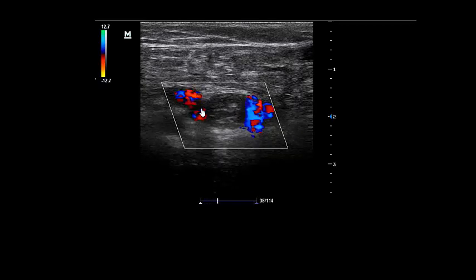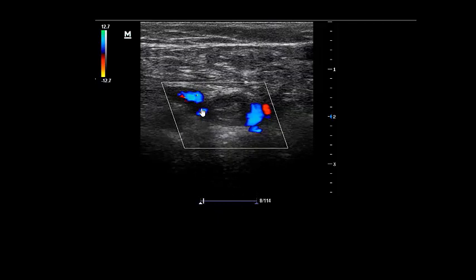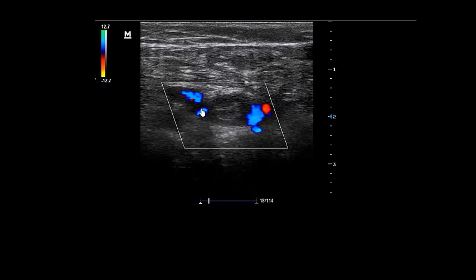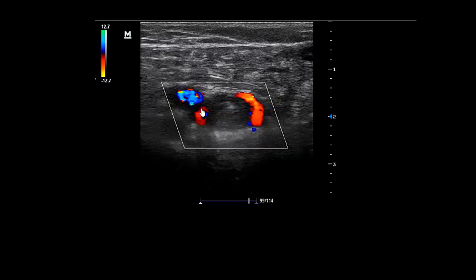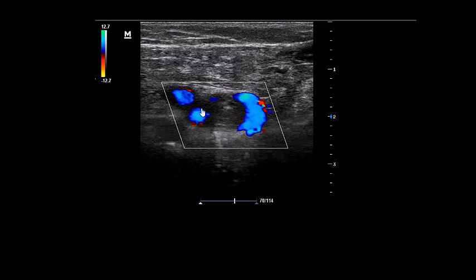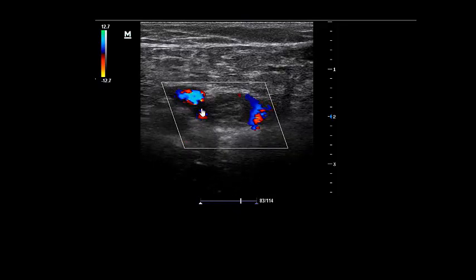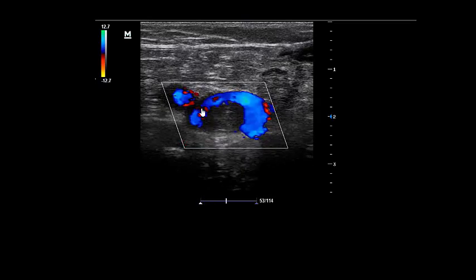So, again and again, if the inferior vena cava is dilated, non-collapsing, you will go to the lung. If you find cardiogenic pulmonary edema profile, which is thin pleura with homogeneous B-lines, go to the heart to know the cause of the cardiac lesion which leads to cardiogenic pulmonary edema. If the inferior vena cava is dilated, non-collapsing, and you went to the lung and find the lung completely normal, you should think about pulmonary embolism and look for signs of pulmonary embolism in the heart.